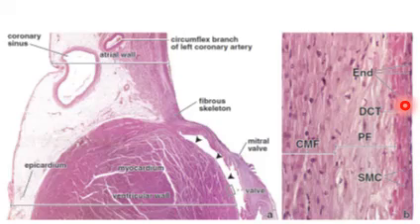As I stated, we have nuclei of smooth muscle cells. We may observe smooth muscle cells within the heart. This is extremely important information. Just below it, we have this layer, as will be stated in the next few slides, the Purkinje fibers, and you should observe that the Purkinje fibers appear much lighter and larger in size than the cardiac muscle fibers.